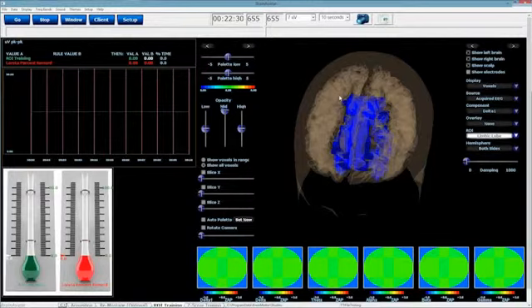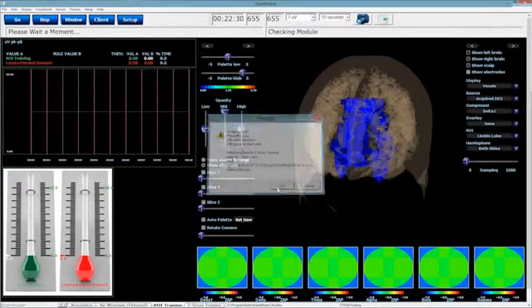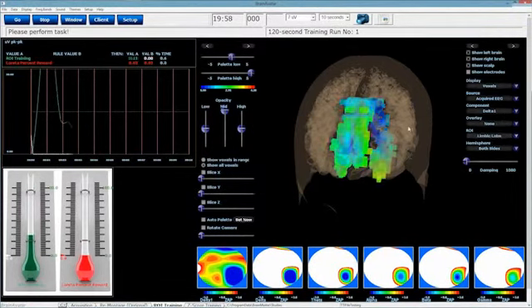For example, if you are working with someone and you're using a protocol like I'm using right now, which is a very popular protocol, a Zscore surface training with ROI amplitude training, what's nice is you can start the day off saying, I'm going to train here. And you can start training there. And you can also change the component, and then it's going to go. But know if you go, I want to look here, it's going to change that too. Let's see what I'm actually doing in effect. So we can kind of see exactly what I'm referring to more than anything.